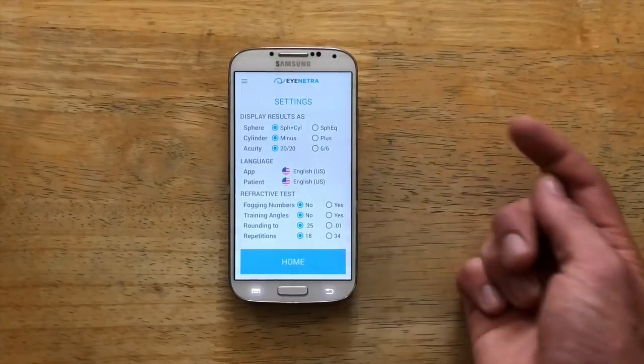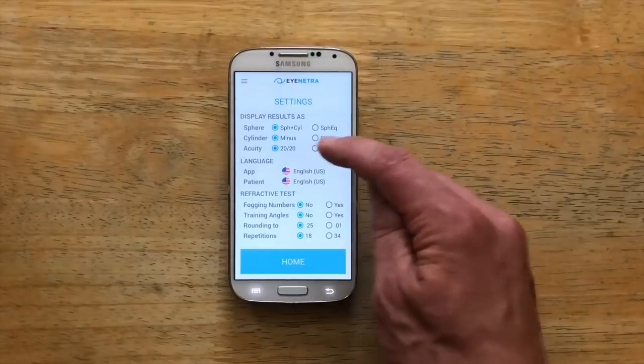The last option in this section is for the acuity tests. You can choose to input in either feet or meters, so you can choose the standard 20/20 or 6/6 notations.